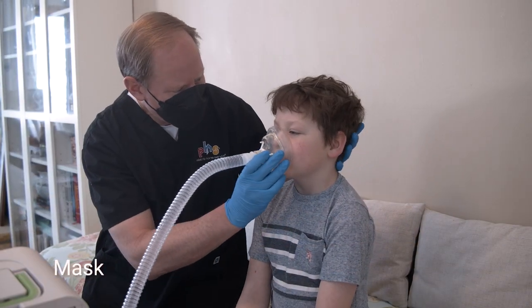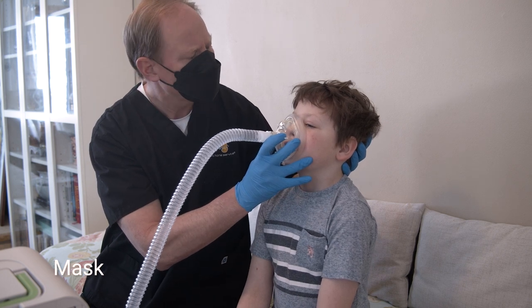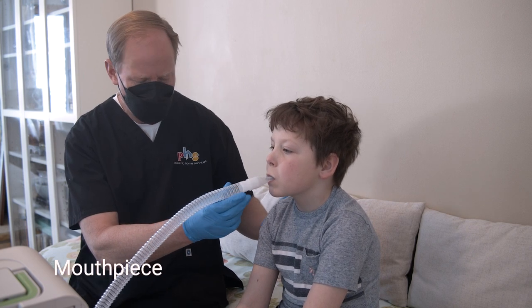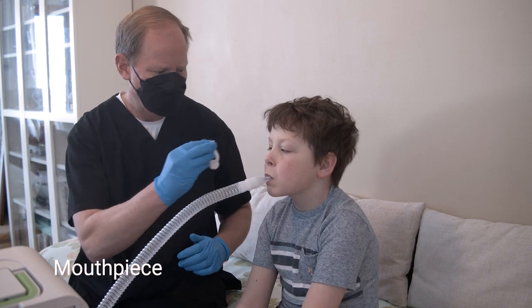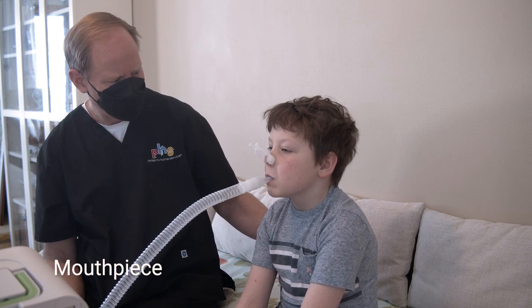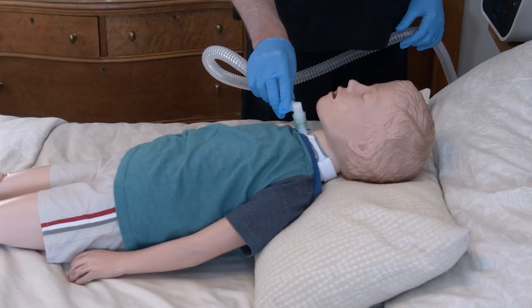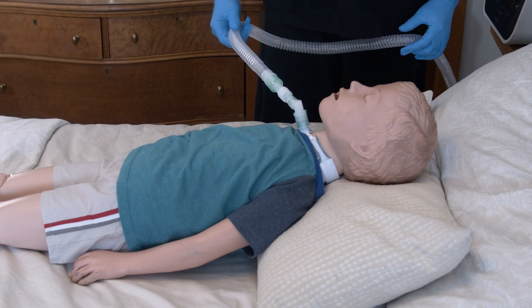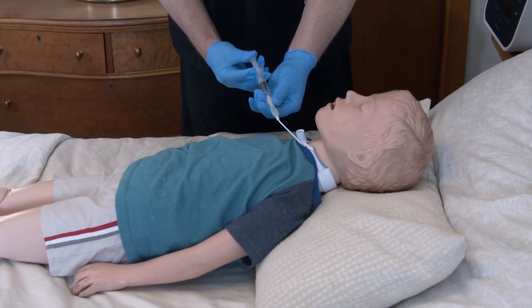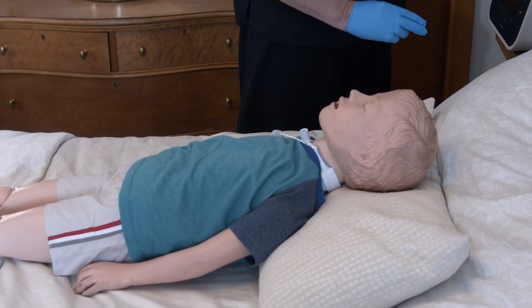Put the mask over your child's mouth and nose, making sure their chin is up and the mask forms a tight seal on the face. You can also use a mouthpiece and nose clip — put the mouthpiece into your child's mouth and the nose clip on their nose to prevent air from leaking during the treatment. If your child has a trach tube, attach the adapter to the trach tube. If it's a cuffed trach tube, check your child's care plan, as breath stacking usually requires that the cuff be inflated to maintain pressure in the airway.